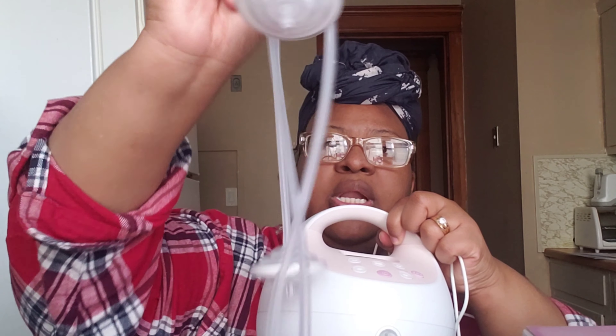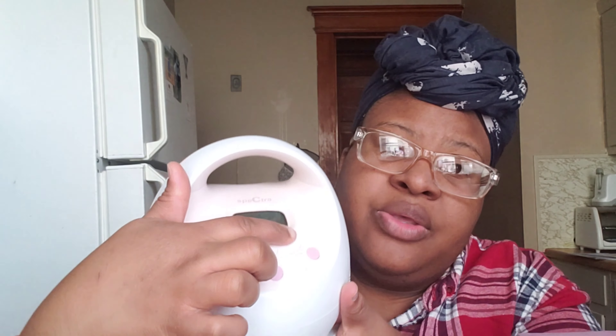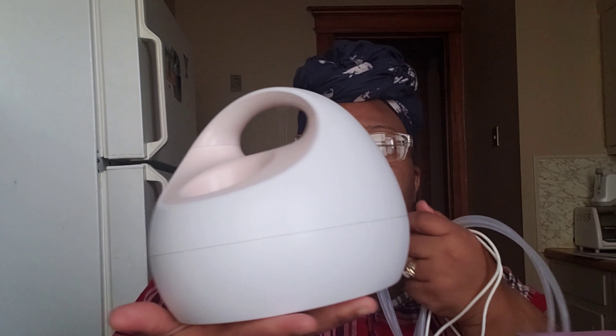It has the holes and the two connections for the holes, and these are going to be connecting to the pump plates. It has the cycle buttons and the vacuum button — you can go up or down on the cycle. This is the power button, and this is the vacuum up and vacuum down. It actually has two levels of lighting: one is more dim and one is more bright. It's pretty lightweight — I bring it to work with me sometimes.